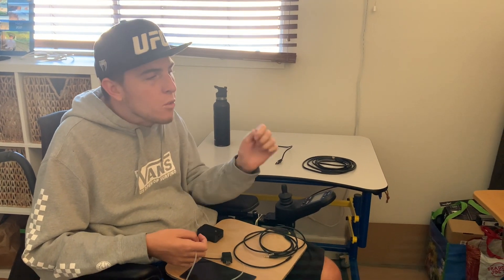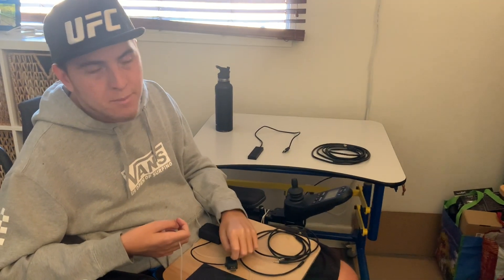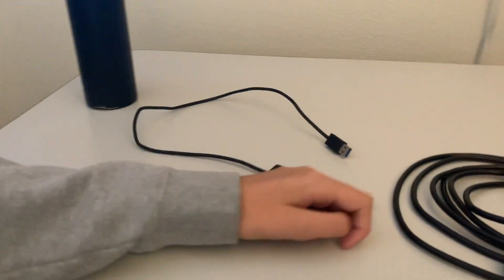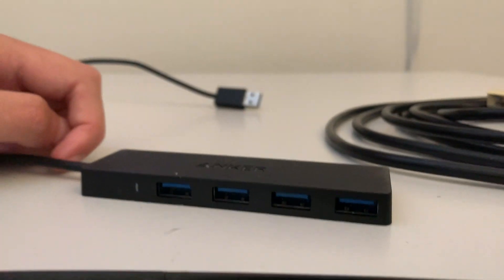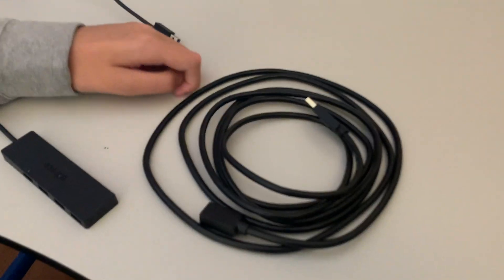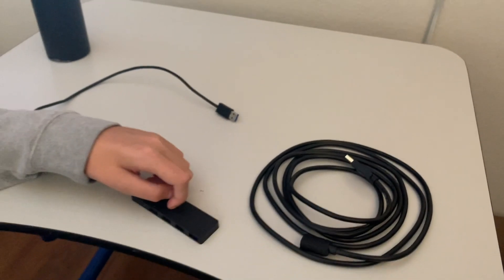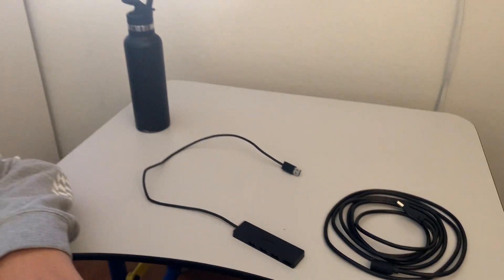I also need a USB port for the sip and puff, so on Amazon I ordered this USB hub — you can see these are all external USB ports — and then I also had to order this external cord to plug into the USB port, with the other end plugging into the sip and puff. It sounds kind of confusing but I did have to order these two separate items to make everything work.